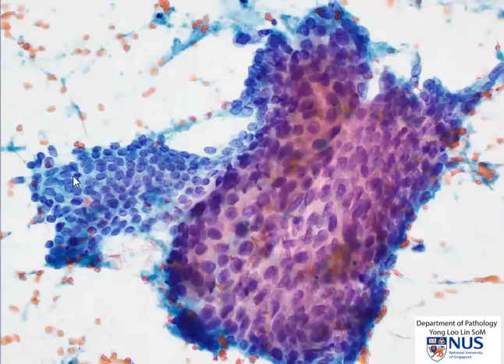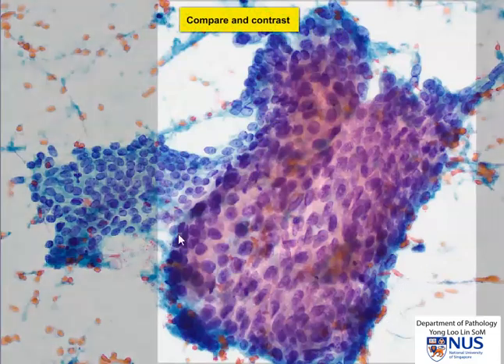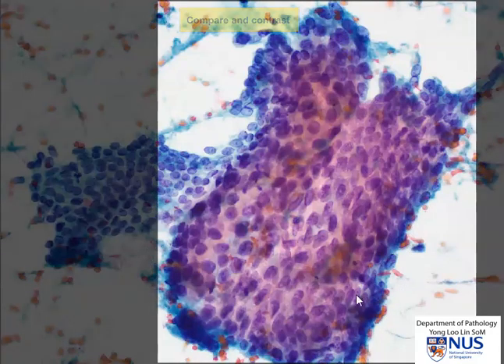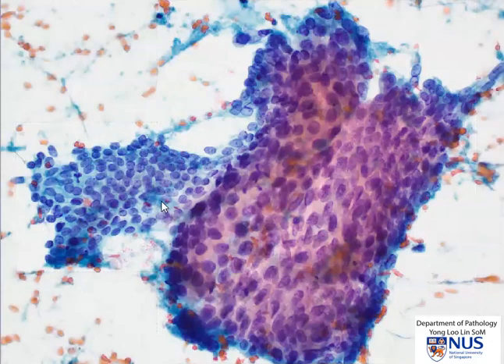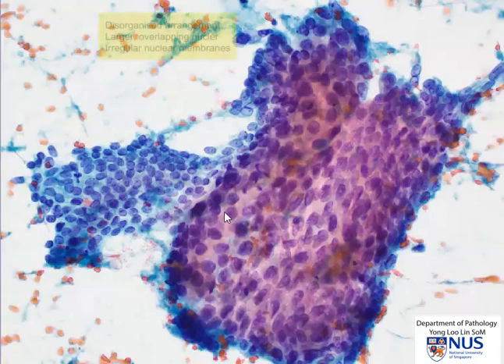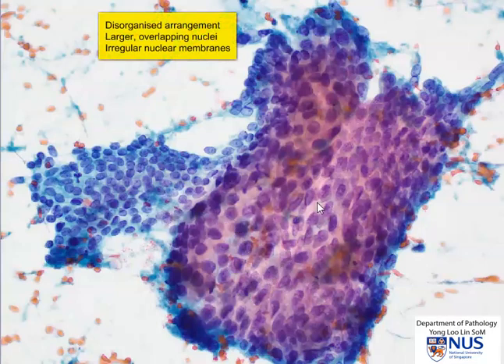When we look at this area, I just want to contrast the difference between this abnormal sheet here and this normal sheet here. This again is contaminant GI epithelium — a very regular honeycomb arrangement of cells. In contrast, this sheet here shows much larger nuclei, but also the arrangement is very irregular. Some of the nuclei are overlapping, sitting on top of each other, and there isn't this very uniform honeycomb arrangement.